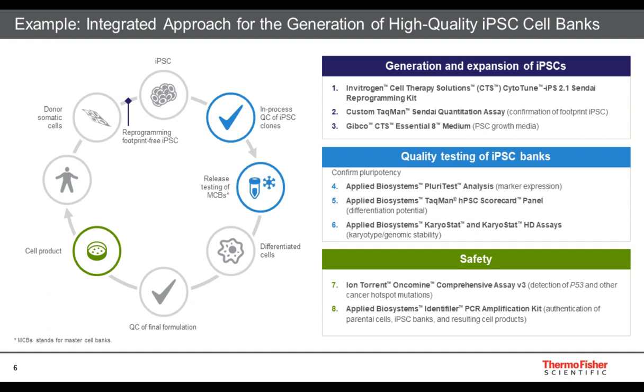I get a lot of questions when I'm in the field about, "Tia, this one didn't reprogram," or "it's differentiating spontaneously," or there's different stuff going on. And a lot of the time you can alleviate many of the pain points involved with pluripotent stem cells if you do this quality testing early on and upfront.